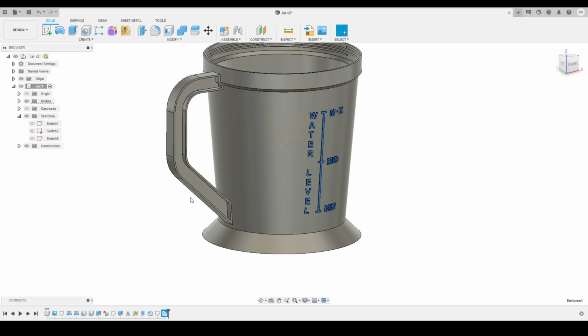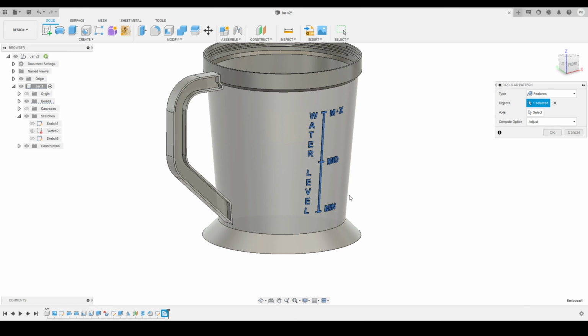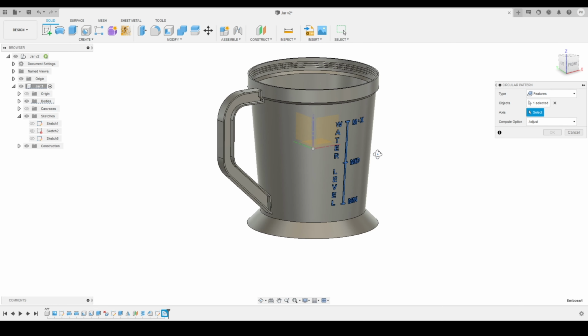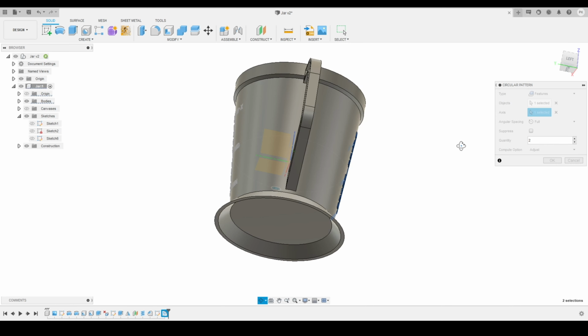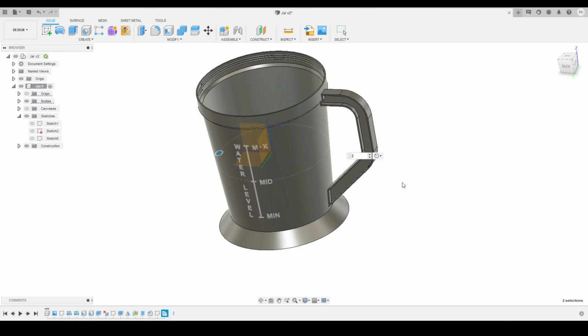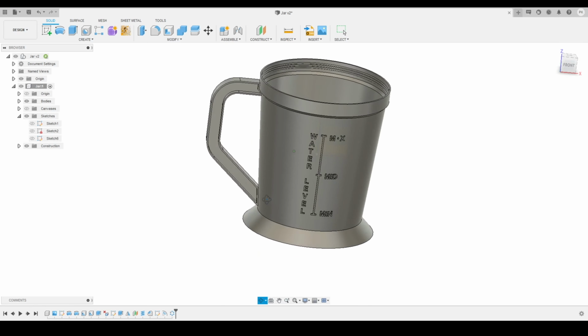Now we'll select the feature that we had created. We'll go to the create tool, we'll activate the pattern tool. Here we want to make a circular pattern, so we'll activate the circular pattern. Here I will select the axis. So if I rotate it, this blue line is our axis, and we'll specify the quantity here as 2, and we'll press OK. So this same feature has been patterned on the other side as well, just on the opposite side of the jar. So here you can see we got this on both sides. So our jar is now finished.